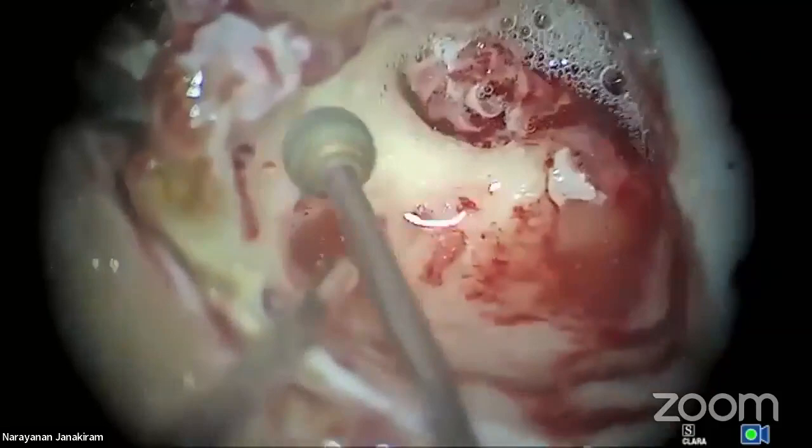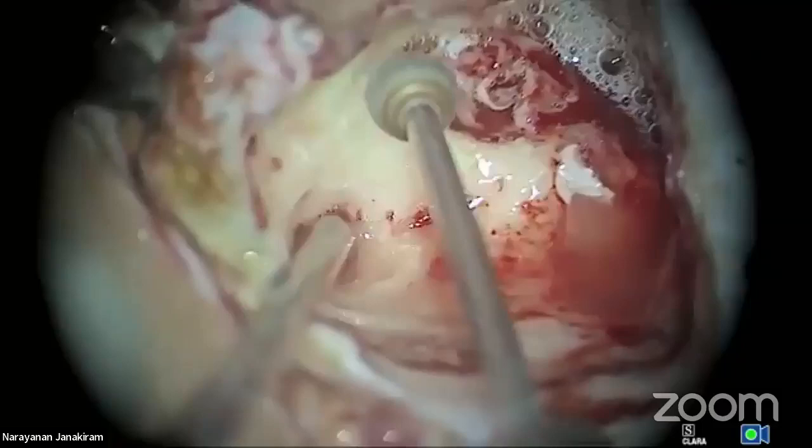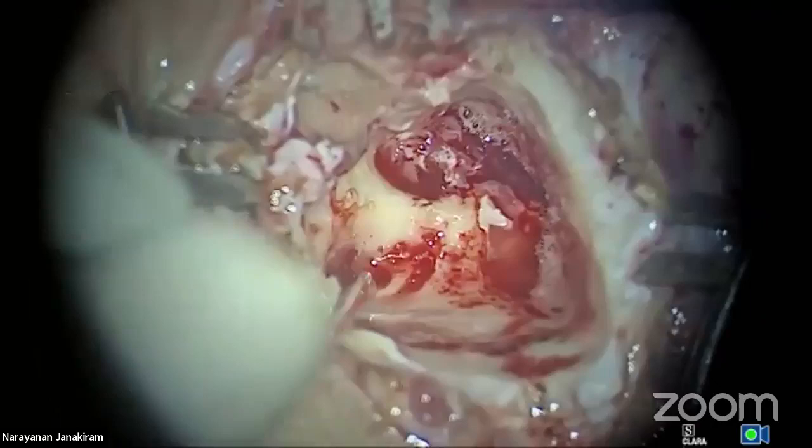So if you get the digastric ridge, see how much we have reduced the facial ridge. Can you see that? It's almost nil. My dear friends, can you see that? Now see, almost zero. Now, this is the level of the facial now here. I can see that very clearly here, but I can reduce a little bit more here.